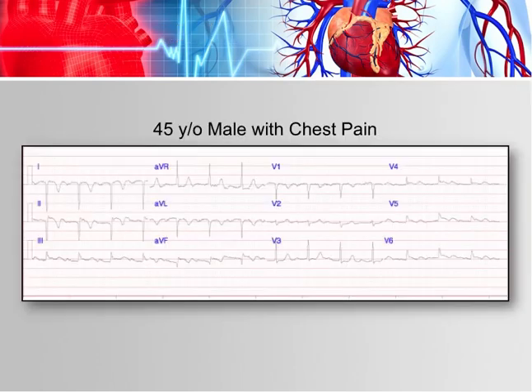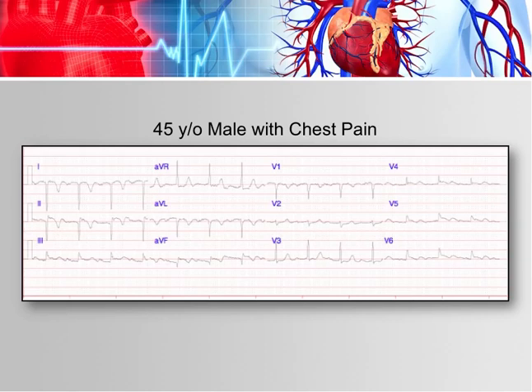Take a look at this 12-lead EKG. It's from a 45-year-old male who is experiencing chest pain. Given what you know now about EKG interpretation, I want you to think about what you would do for this patient based on this 12-lead alone — what sort of actions would you take and what type of treatment you would provide.